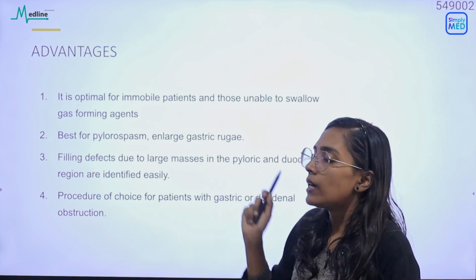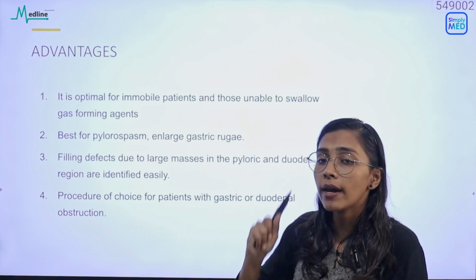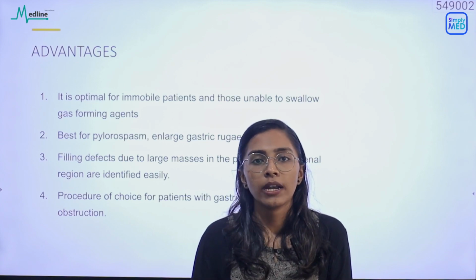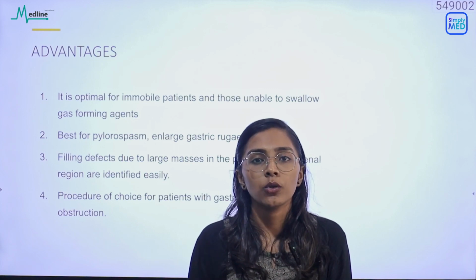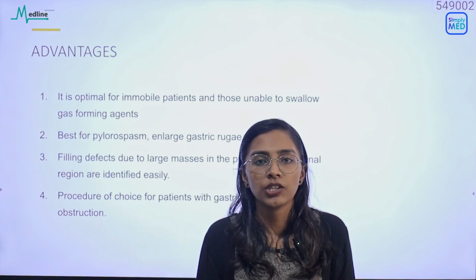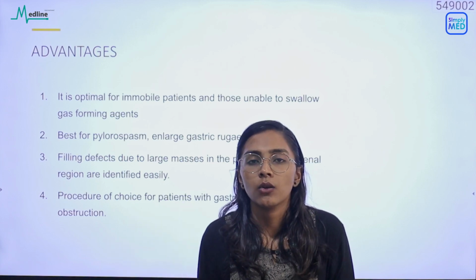Now the advantages of single contrast studies: this is the optimal study for immobile patients and those who are unable to swallow the effervescent powder or tablets. So for patients who are immobile, and also for patients who cannot swallow the gas producing tablets, a single contrast study is the best one. Because for a double contrast study we need the patient to swallow the gas producing agents, right? So if they can't do that, then the only available one is the single contrast study.